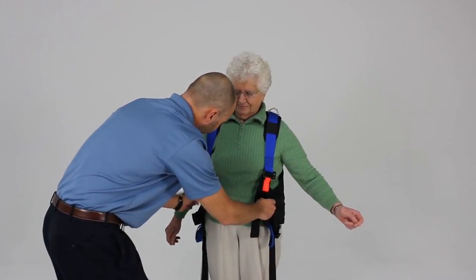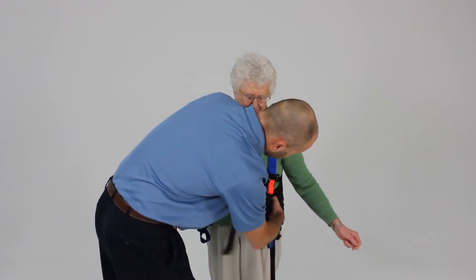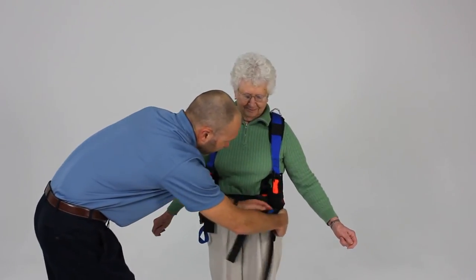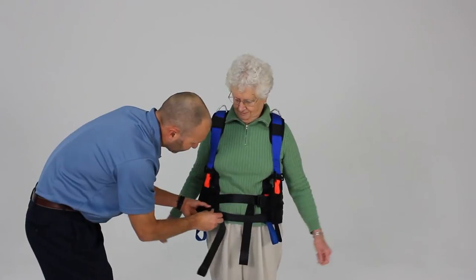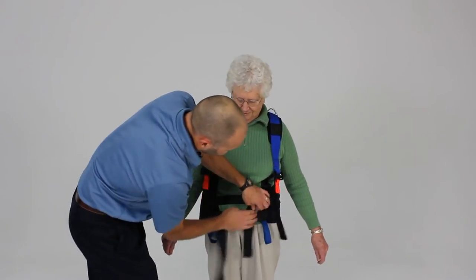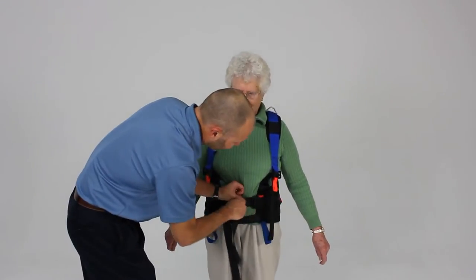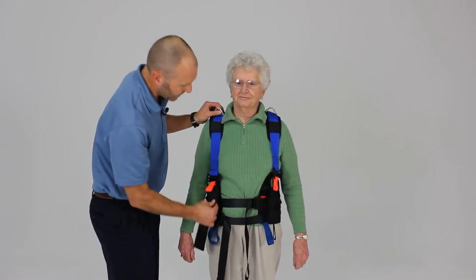We're going to go ahead and attach our waist straps. There are two waist straps placed on opposite sides of the belt. We're going to adjust and tighten those as comfortably — as tightly — as the patient can tolerate.